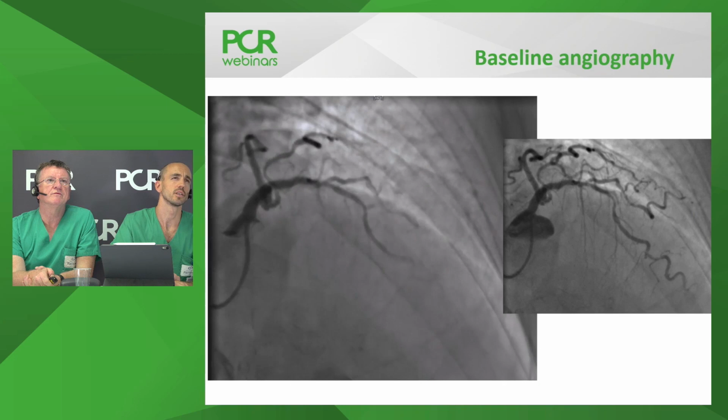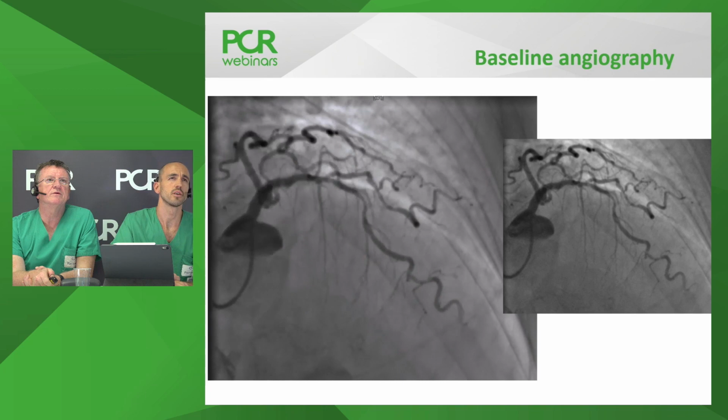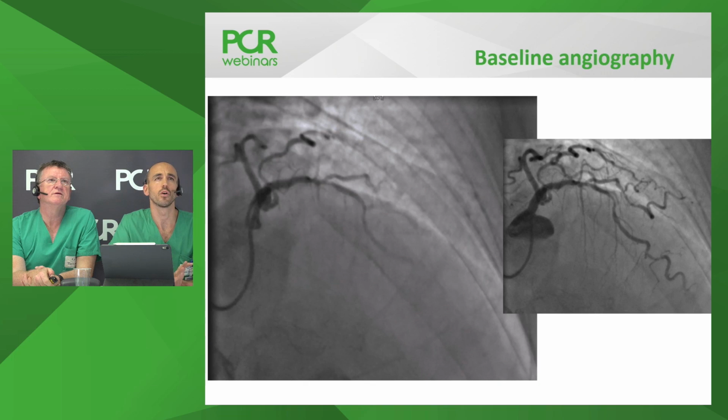You always have the LAD lesion. What do you think of the ostium of the diagonal there? The ostium of the diagonal is quite good. So although it's a bifurcation lesion, maybe you will get away without having to treat that. There is some additional disease further downstream in the diagonal. Would you treat that? No. For myself, I will only treat the LAD.